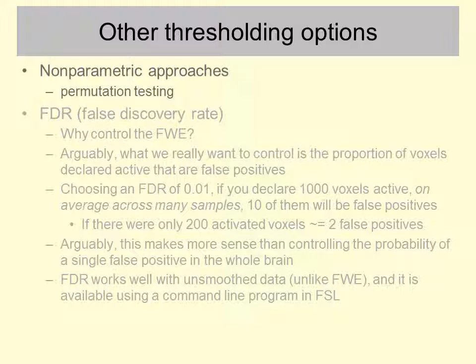Perhaps it's easier to imagine this as a kind of second level t-test design, where you've got one group of participants in one experimental condition and another group in the other. If we shuffle the labels, i.e. we randomise whether participants are allocated to group A or group B, ignoring their actual real allocation to group A or group B, and then we compute means and standard deviations, etc. We know that we've made the null hypothesis true, in a sense, in our shuffled data.